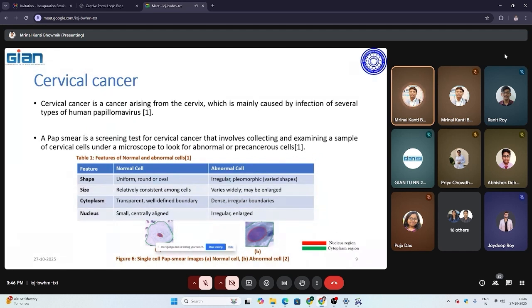The main purpose of the pap smear is to detect abnormal cells which may develop into cancer if left unchecked. Pap test is a manual procedure where pathologists visually examine the microscopic slides and identify any abnormality in cell structure. The visual interpretation of microscopic images is usually labor intensive, time consuming, and subjective.